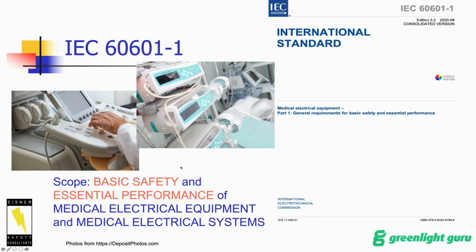And we'll talk about that more later in the presentation. So this slide is just making sure that you know what we're talking about: this is the base standard or the general standard. It's actually IEC 60601-1, and the scope is basic safety and essential performance of medical electrical equipment and systems. And so it's electrical based devices, can be internally powered, which is battery operated.